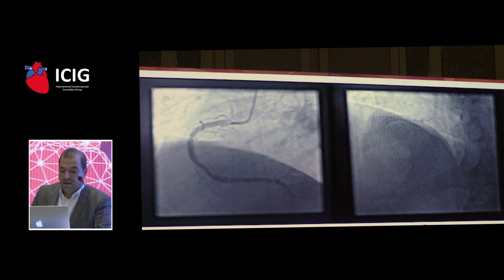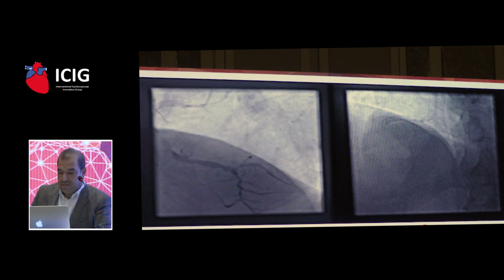He was loaded with ticagrelor because of the active chest pain, plus aspirin and heparin, and was taken to the cath lab. The left system did not demonstrate any significant stenosis apart from non-significant in-stent restenosis in the circumflex and LAD. What I would like to share with you is the right system, based on the EKG changes and the minimal leak of troponin.